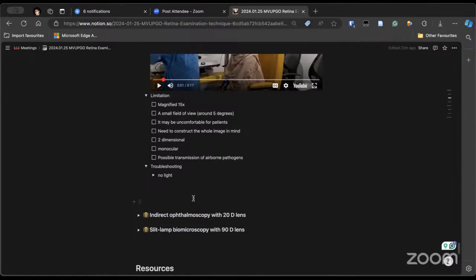Or the connection between the head is not proper. Or we have not switched it on properly, like it is not completely moved. Any other? The bulb can be fused. Any other possible scenario? Any other candidate?